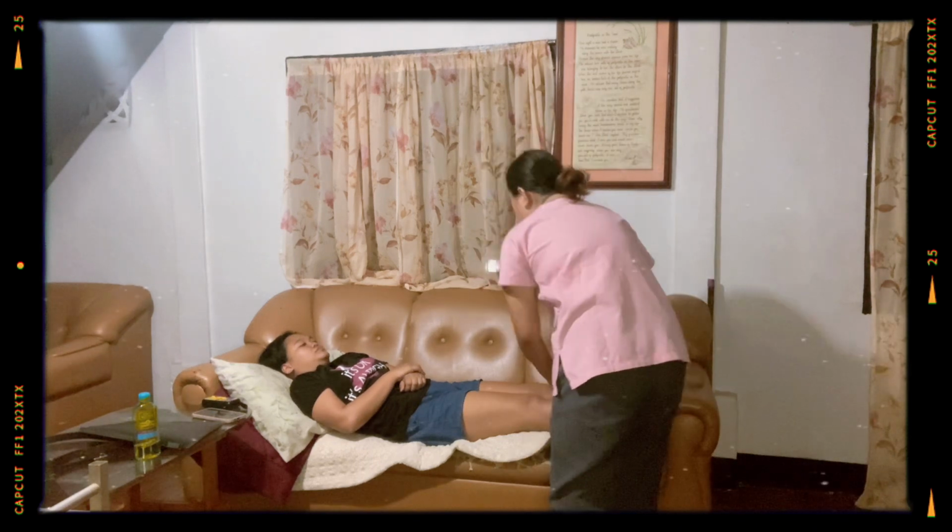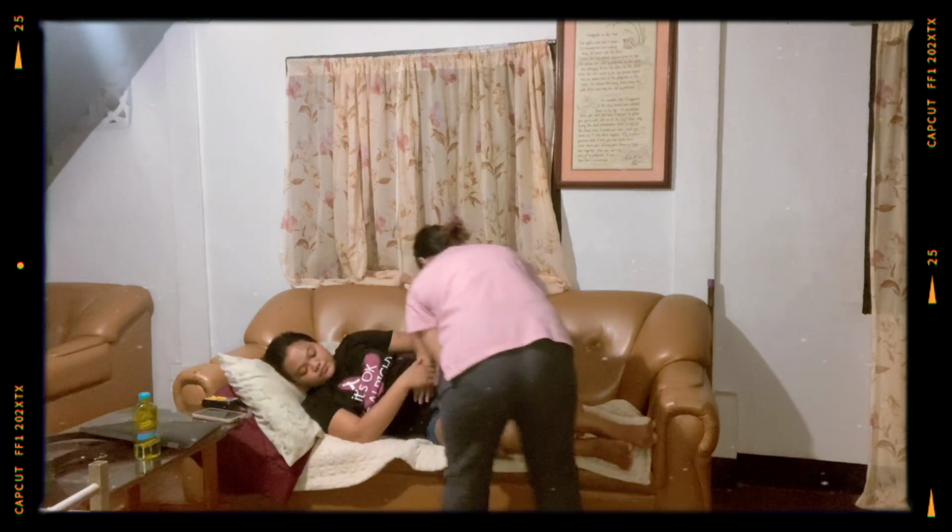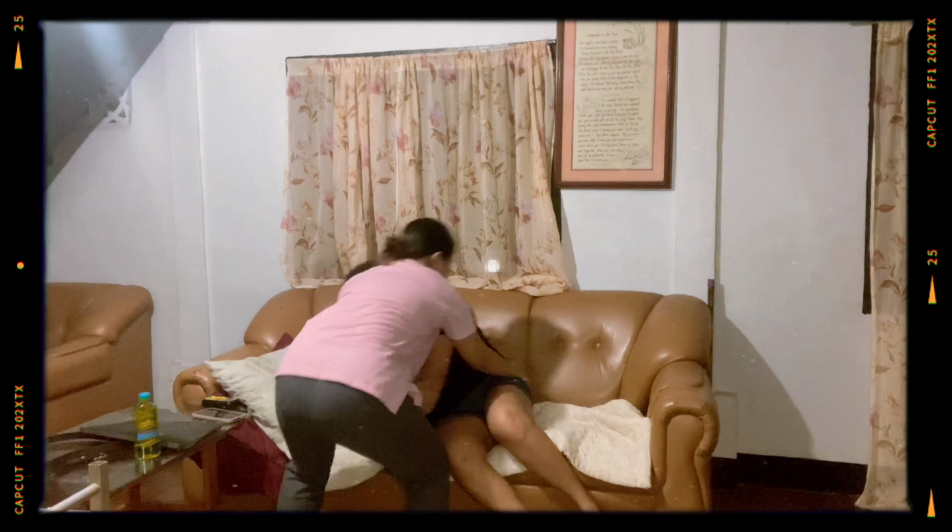Yes, ma'am. So for procedure number 4, encourage the patient to make use of a stand assist aid, either freestanding or attached to the side of the bed if available, to move and sit on the side of the bed. So this is to aid the patient in moving to the side of the bed. So now we are going to assist the patient to move. So, ma'am, I will place your feet there, okay? And 1, 2, 3.